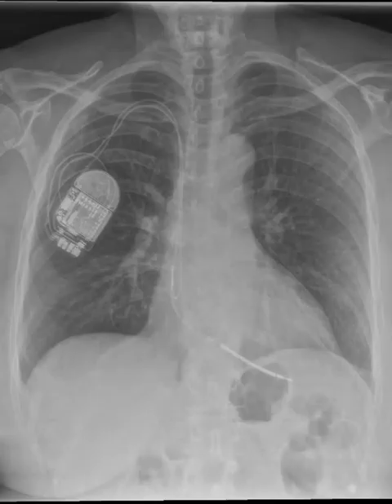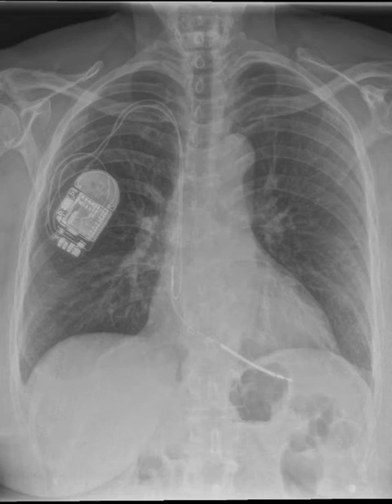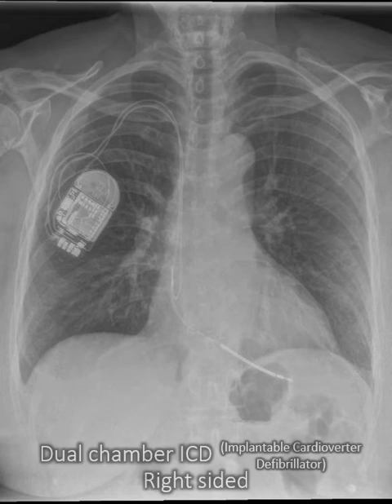What about this one? You can see there is a thick coil here of an ICD. There's an atrial lead, it's right-sided — it's a dual chamber ICD.